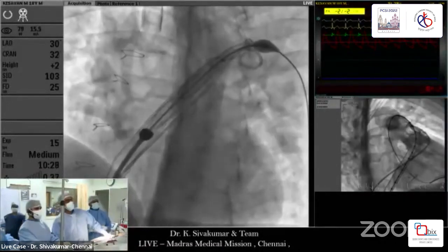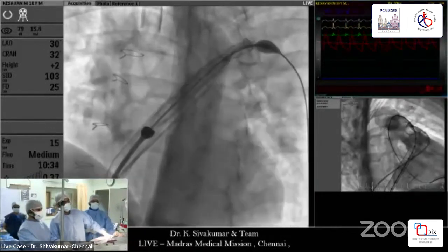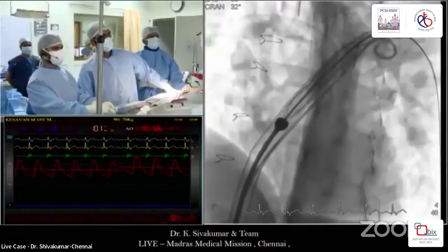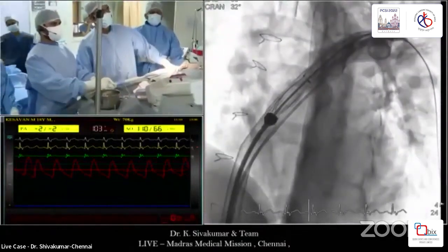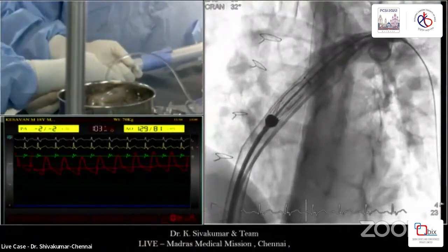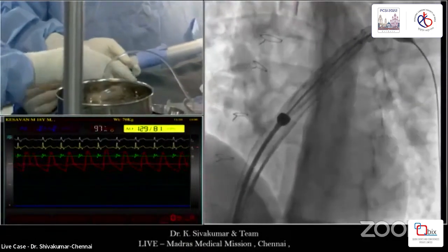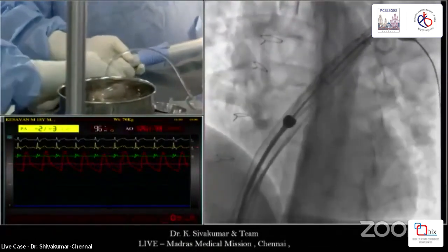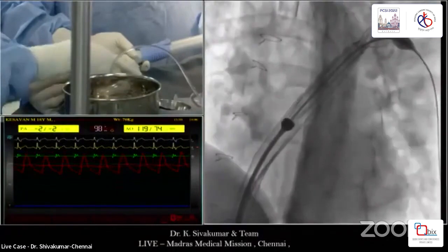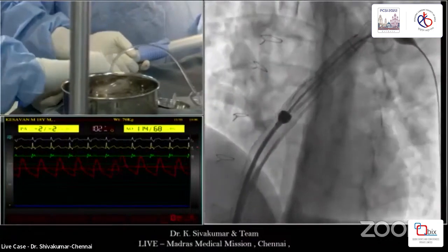So Pramod is now partially trying to open out the distal flare. I will show you the previous picture in the meantime. Show the previous picture and freeze it when the left is seen. Yeah. So we have got our distal markers just distal to the LPA origin. So we are planning to get the valve a little bit opened. Probably I'll wait till the valve is opened up to the distal third so that the LPA flare really opens out a little better.